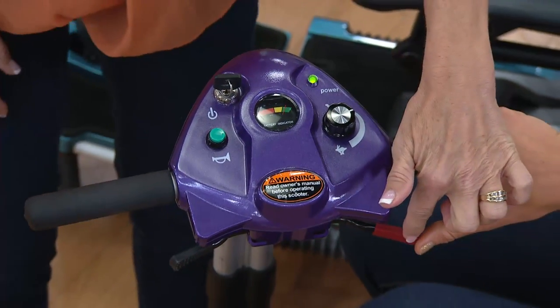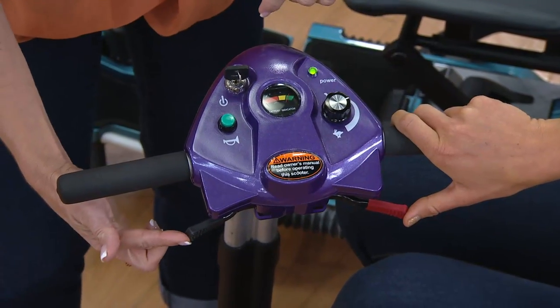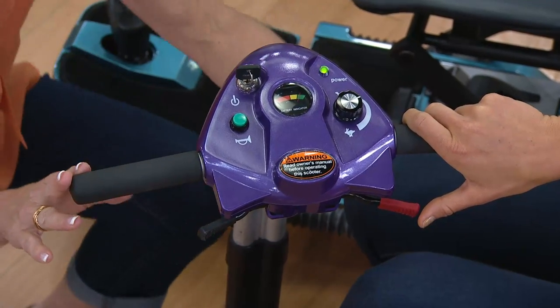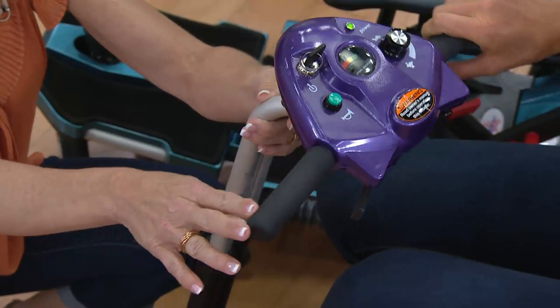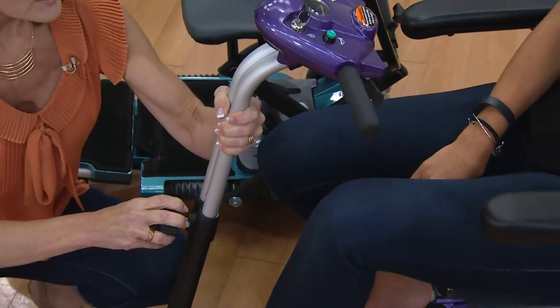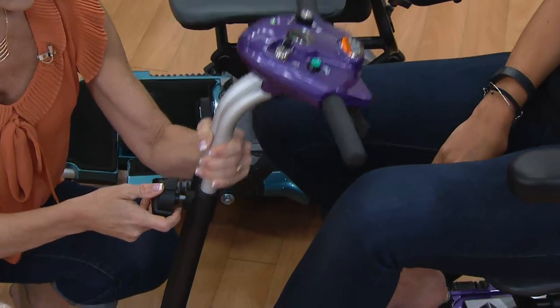Non-slip hand grips. The red lever takes you forward, the black lever takes you in reverse. It's a smooth electromagnetic brake — when you let go, you come to a nice smooth stop. The tiller here is also adjustable; all you do is loosen this knob, and if you have really long legs you can take it up higher, or if you have really short legs, down lower.